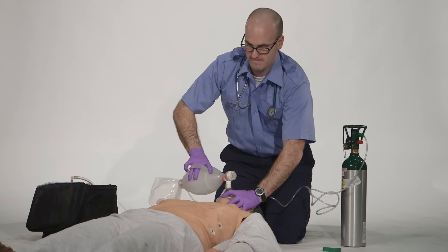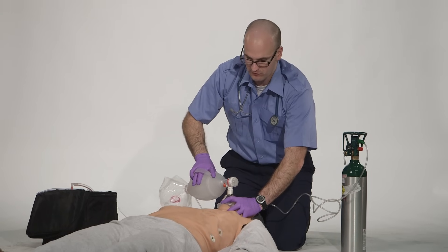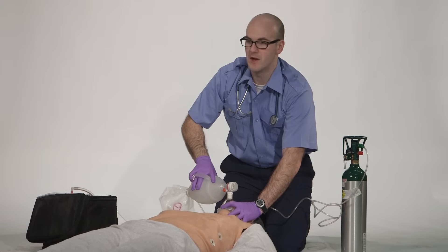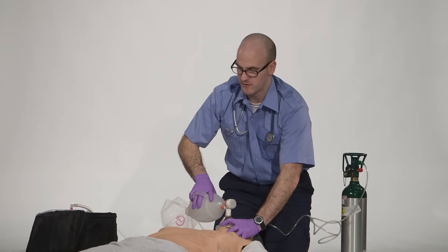How would you know if you were delivering the appropriate volumes with each ventilation? I would look for equal chest rise and fall and an adequate amount of chest rise and fall. Is there anything else you'd like to do? Nope, that's it.